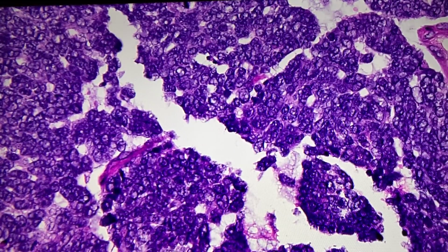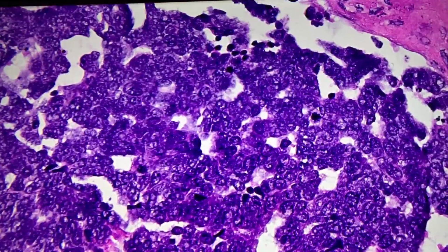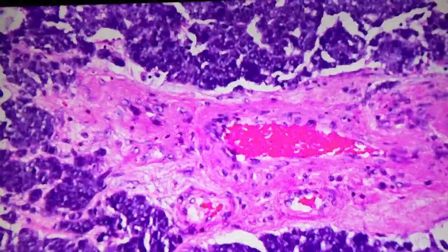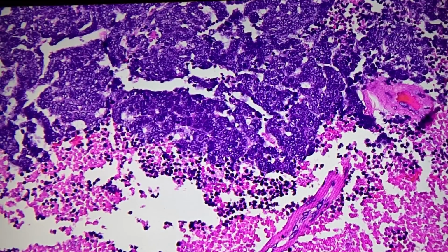So this is metastatic Merkel cell carcinoma to the brain. And I think the point is that it can so mimic other small round blue cell tumors. So unless you knew the history, this could be a difficult diagnosis. You could easily go down the wrong path in these. I think I recently showed you one that was a differential of a lung small cell, right? So it can really fool you. But in many cases, I don't want to say most, you already know the history from before, so all you need to do is confirm.